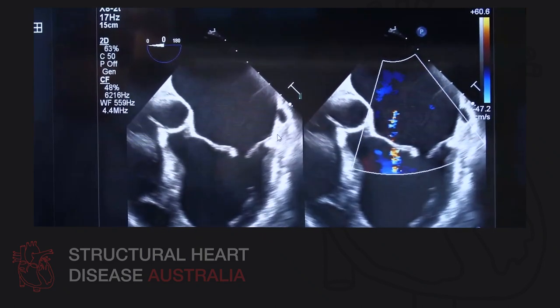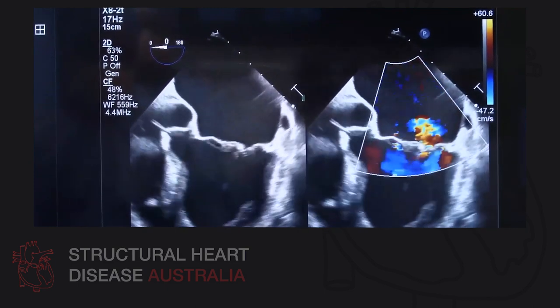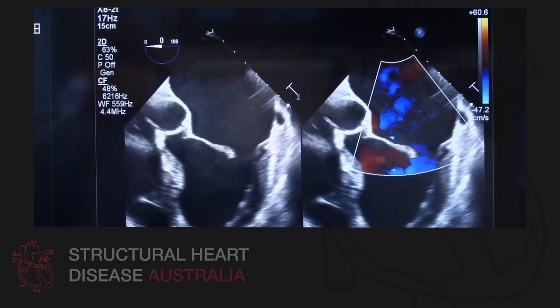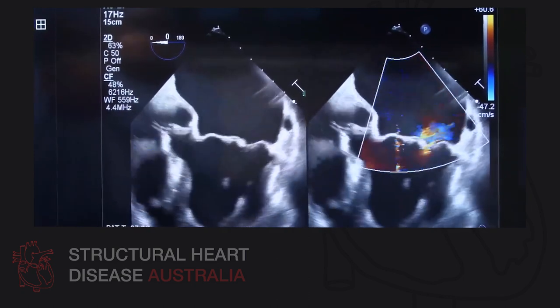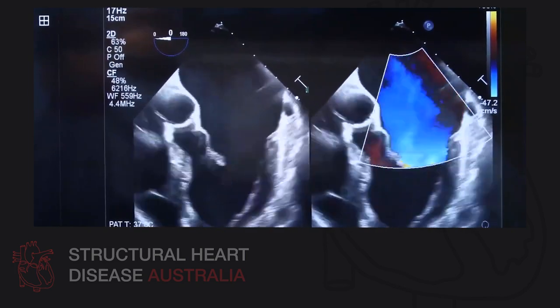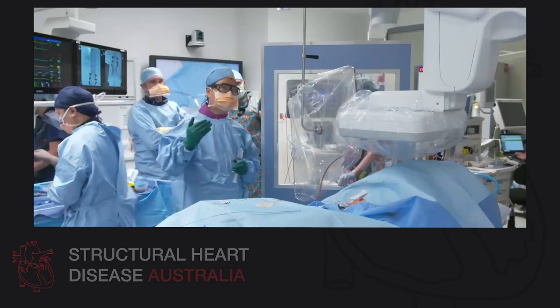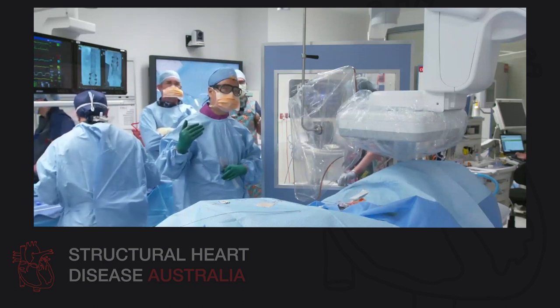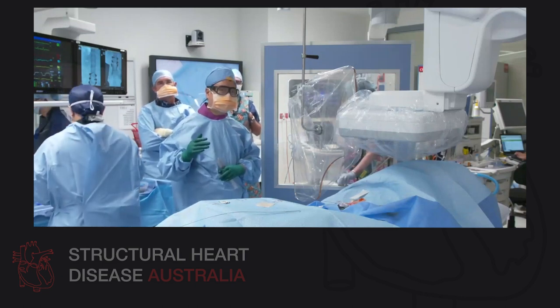And you can see that in the context of the atrially mediated annular dilatation, there's a shift in the mitral coaptation point slightly towards the atrium. This is distinct to ventricular functional mitral regurgitation, where the mitral coaptation point is often shifted towards the ventricle because of tethering of the leaflets. This pathology really means that because of the slight atrial shifting of the mitral leaflet coaptation point, we are aiming to have a reasonable height with our transseptal puncture today, aiming for between 4 to 5 centimeters.